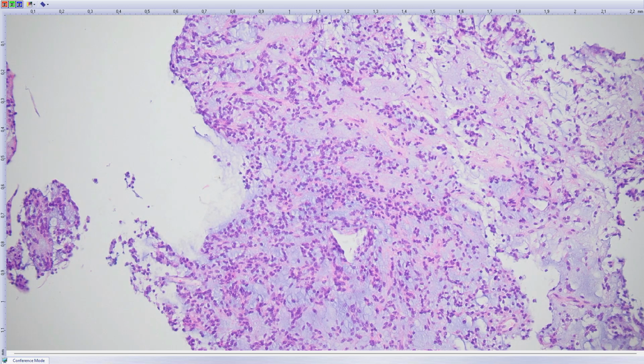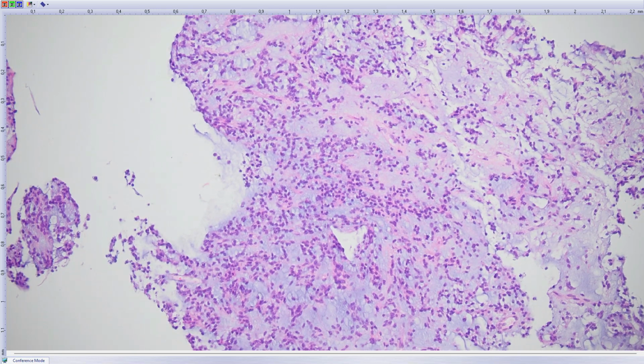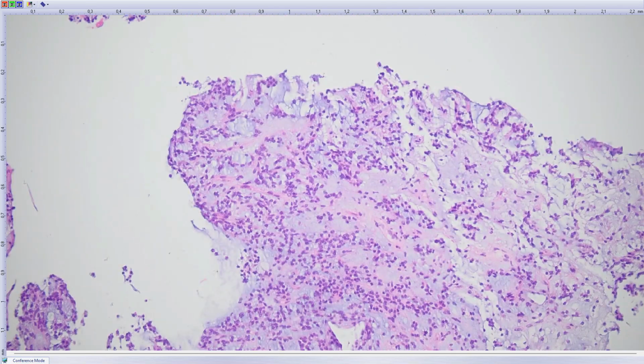So anyway, it's a low-grade lesion, but this pilomyxoid astrocytoma, just because the growth pattern is not that well circumscribed, is myxoid, may envelop adjacent structures, including optic chiasma and nerves. It's harder to resect, and the recurrence rate is a little bit higher compared to pilocytic astrocytoma. So the second diagnosis is pilomyxoid astrocytoma, probably grade 1.